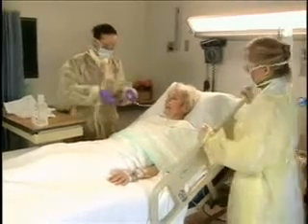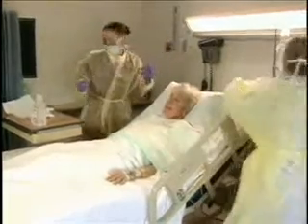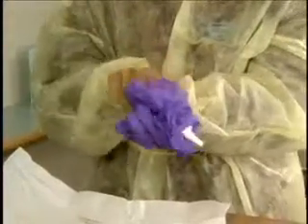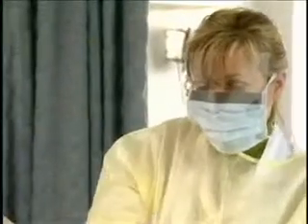Okay. Very good, Mrs. Marconi. I'll just wrap the catheter inside my gloved hand and remove my gloves by containing the catheter inside the gloves. Great. Now dispose of them and any other used supplies in an appropriate container. And let's get out of our PPE.